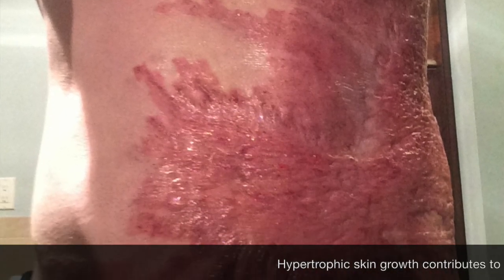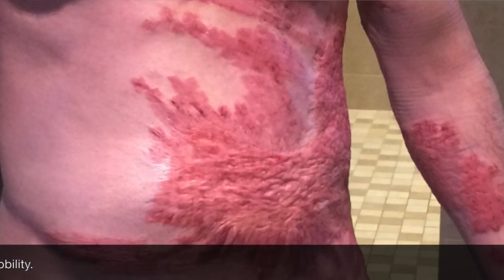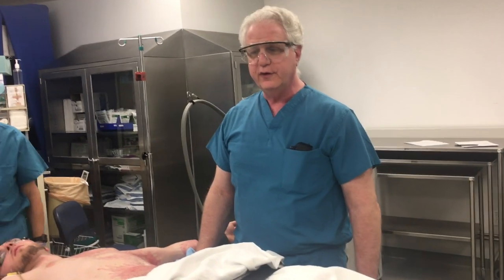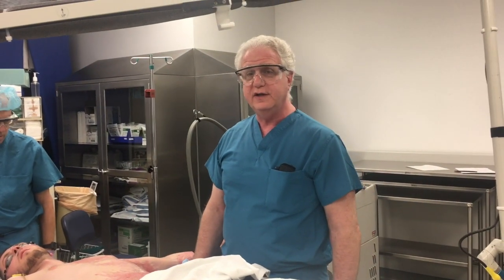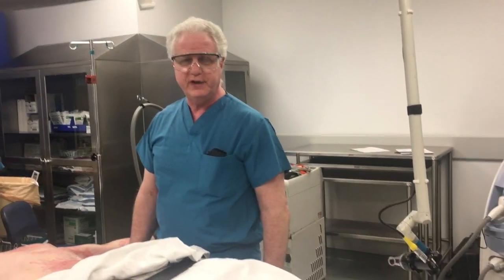This patient has been both skin grafted as well as treated with secondary healing. Today's intervention will be his second of these particular laser treatments. The results are quite significant and quite helpful to each of these burn patients.